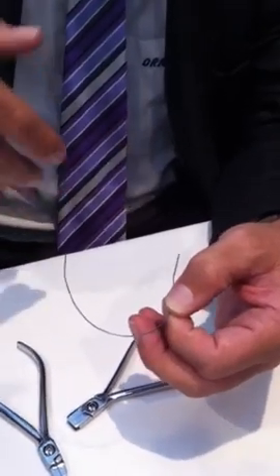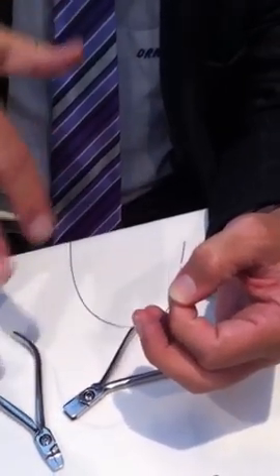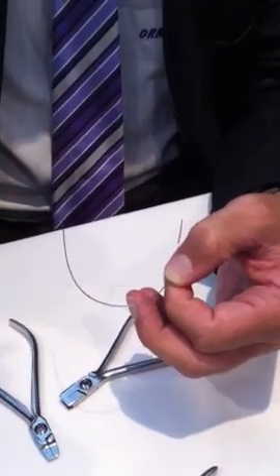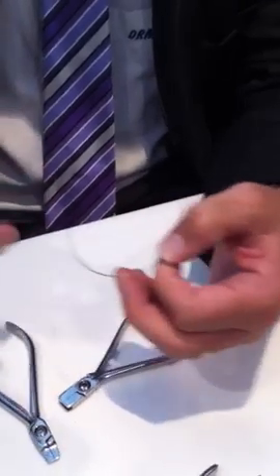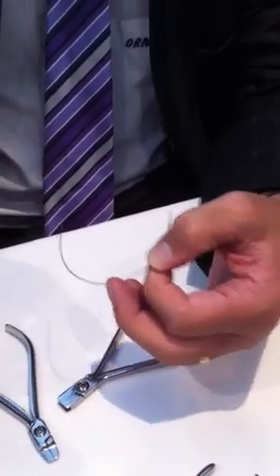I might do this in a case that is div 2 to start, and in my strongest wire I haven't expressed enough effective torque and I want to add a little bit more. In the lower arch, I can put in negative torque when I'm running Class 2 elastics to stop my lower incisors from dumping.